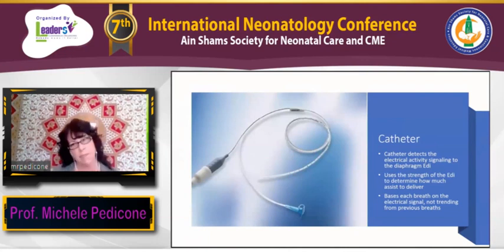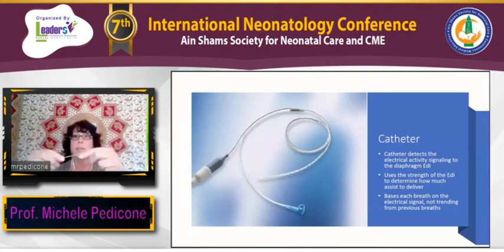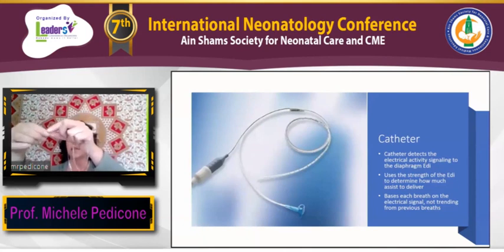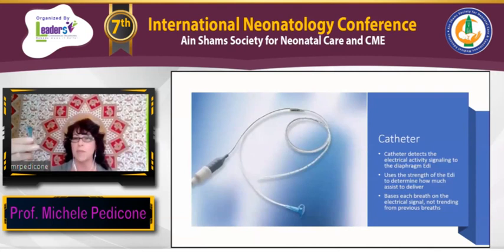So the NAVA catheter, and I happen to have one here right now, I don't know if you can see it, but here is the NAVA catheter. This NAVA catheter has electrodes embedded in the base of the catheter here, and I can feel them by running my fingernail over them. This catheter has a port right here where you can hook up a feeding tube. You can feed the baby through this catheter. You can administer medications. And these electrodes in the catheter measure the diaphragmatic activity 62.5 times per second. So you know that is going to be very synchronous and in real time.